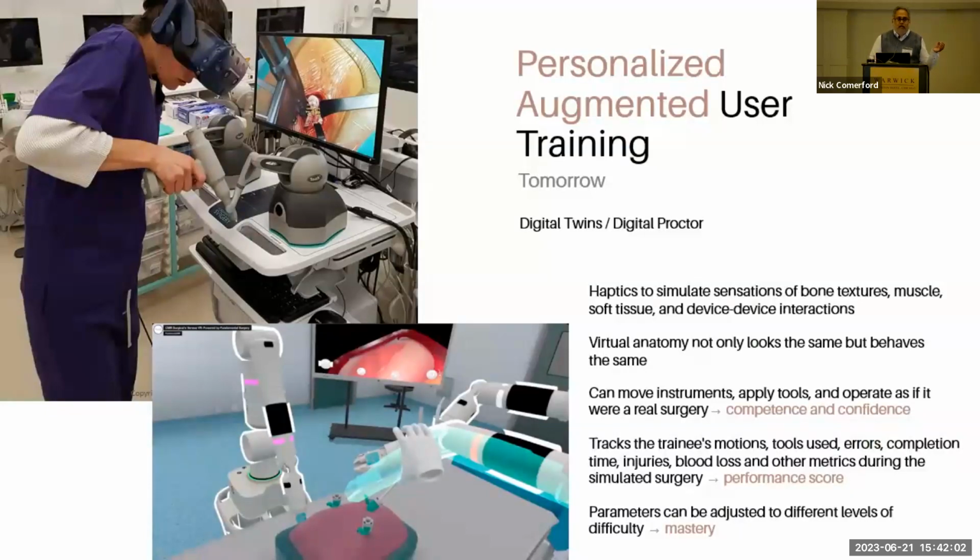Now, to build this type of AR training, we get into almost the exact same criteria we just talked about with good simulated environments for summative evaluations. The term that you'll see used a lot here is digital twins. It's a term that started in other industries. You see it in automotive, semiconductor, oil and gas, areas where it was not possible to always have the real devices in the real location, but a normal simulated model will not be authentic enough.